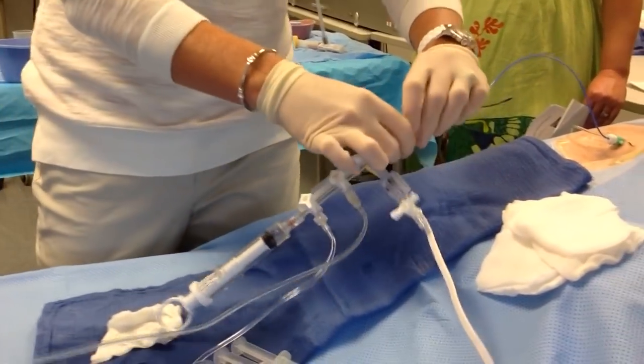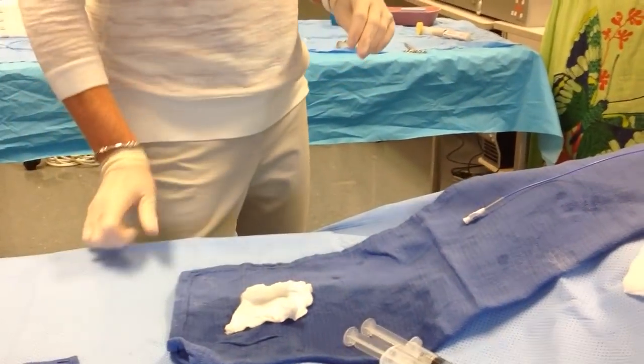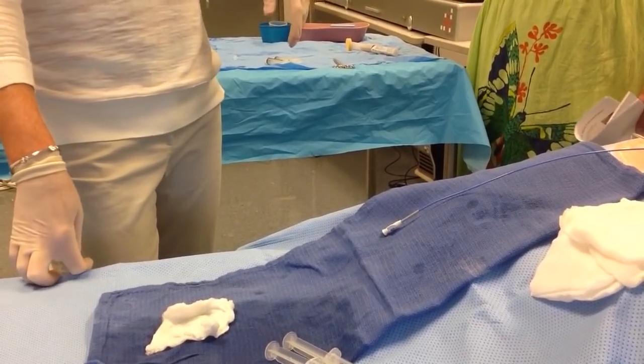Okay? So we're done with that. We disconnect. Do you check the pressure in between each injection just to make sure that it's the catheter? You always want to be back on pressure. Yep. Okay. Yeah.